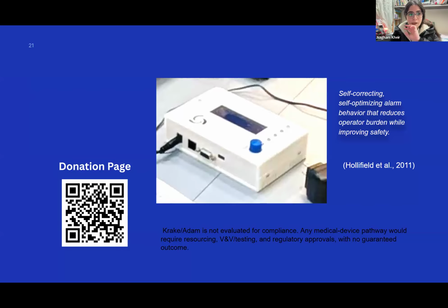But then what is actually done is also documented. And then it does the comparison for you about how we should deal with an alarm versus what was actually done, right? And then it gives you that report that you can use and analyze.